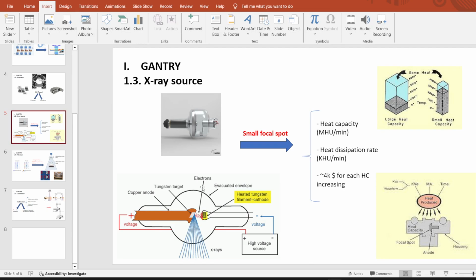And in here you got electrons. Can you see that? Electrons, my friend. Electrons are the electricity, and the electrons bombard the anode. From this point, the X-ray beam is created. And how does the electron beam affect the X-ray quality or quantity?